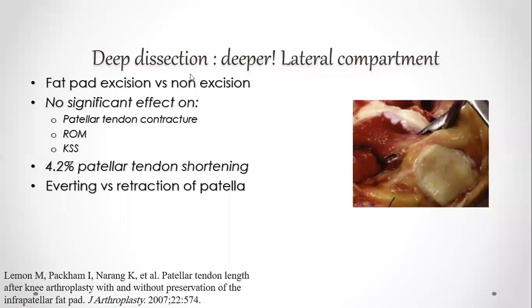So again, after that, you now have a well exposed and everted knee. But regarding the patellar fat pad excision versus non-excising on the patellar tendon, this is also a dilemma.